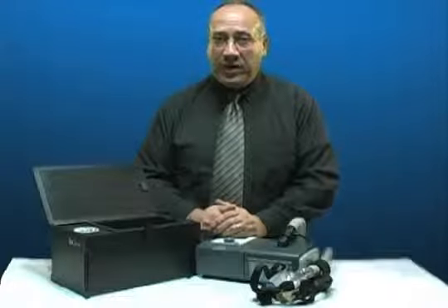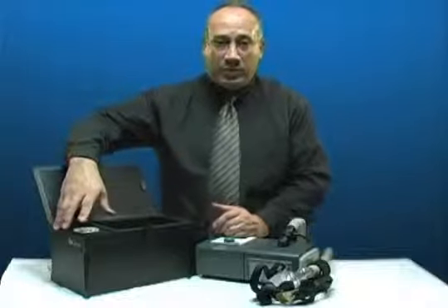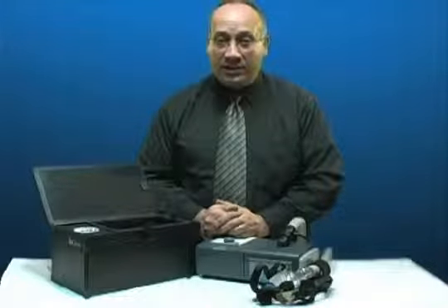Let me explain briefly about how your SoClean works. Inside the mechanics, we produce what's called O3, or activated oxygen. Activated oxygen is known to be a natural and strong disinfectant.